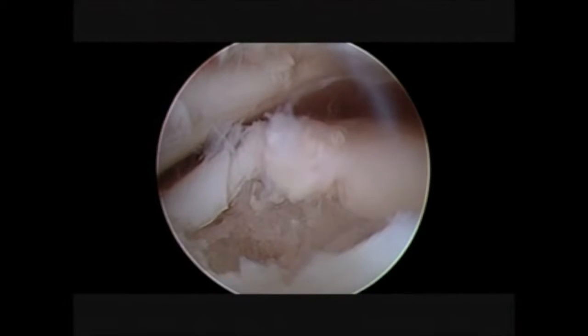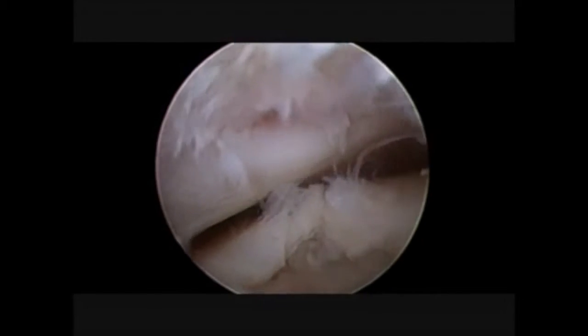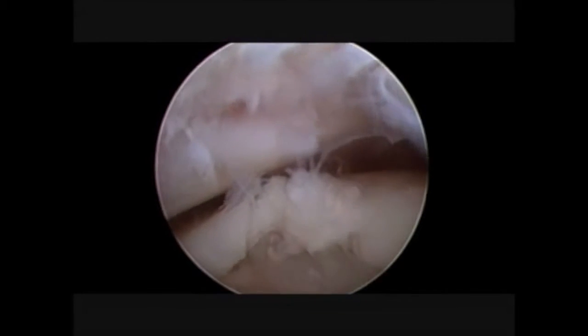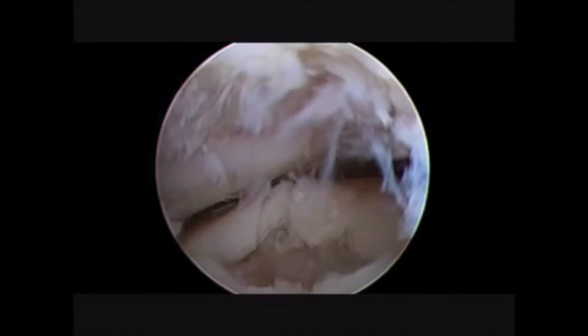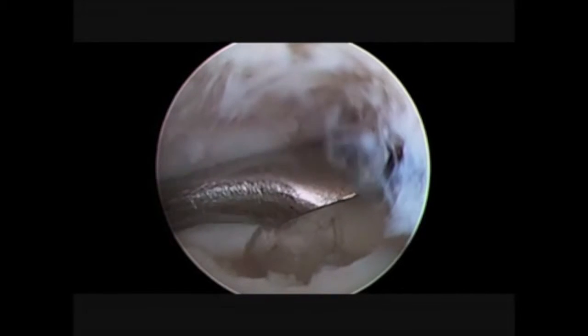Our patient is in supine position. We have already cleaned the joint in order to access the lesion and we have already applied the distraction through the Hintermann retractor. Now you can have a better view of the osteochondral lesion.